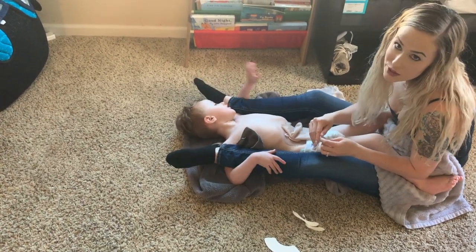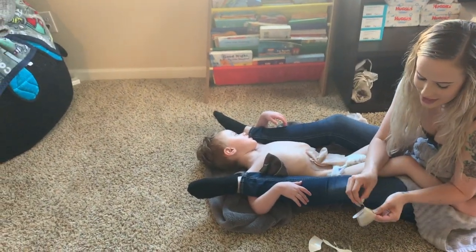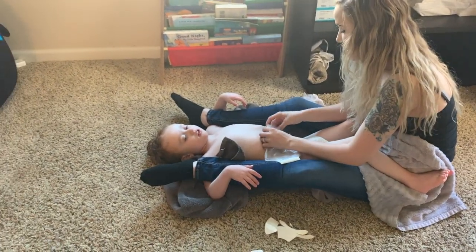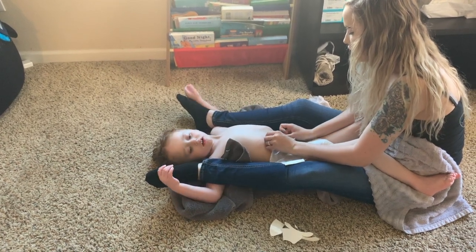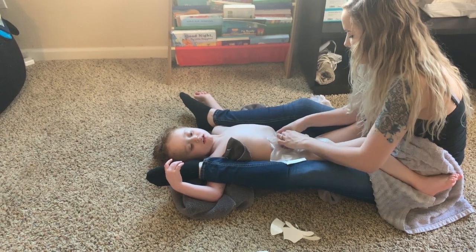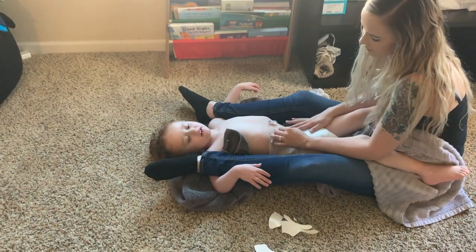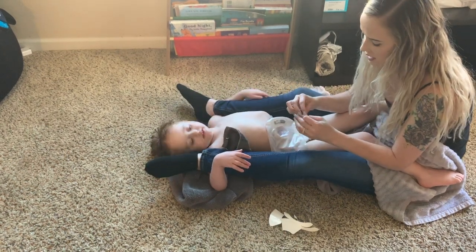When you're first getting used to ostomies, an important thing to learn is that you're not gonna perfect it the first time, and you'll have to learn how to get into it, because one time we changed 10 ostomy bags in one day because we just couldn't figure it out, and I felt so lost when we came home from the hospital, but now I can literally do it in 5 minutes.